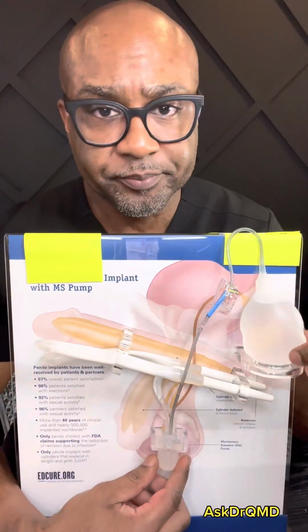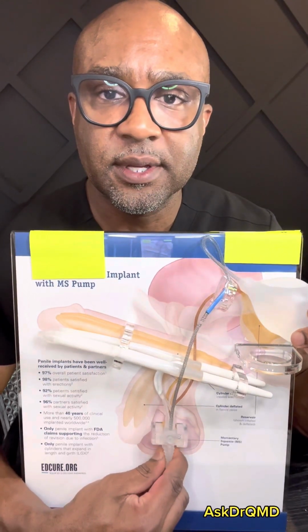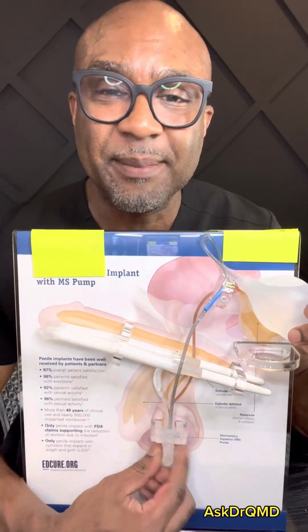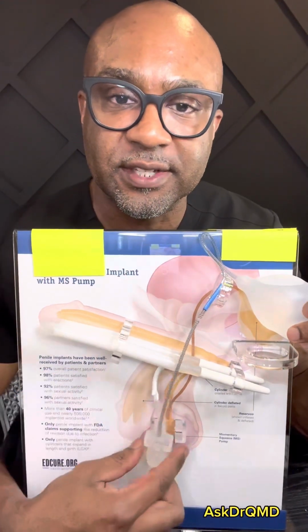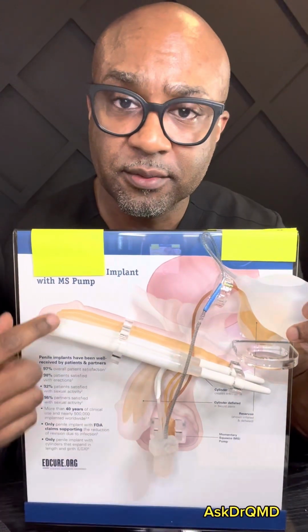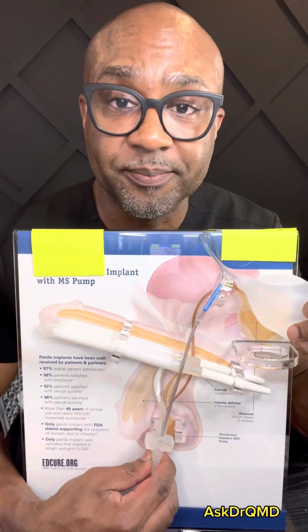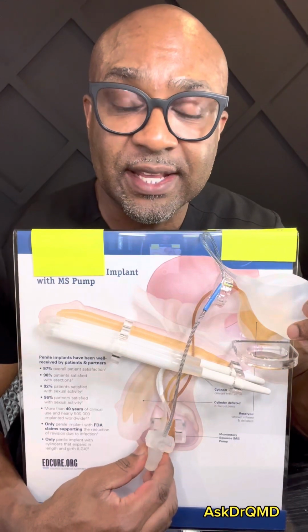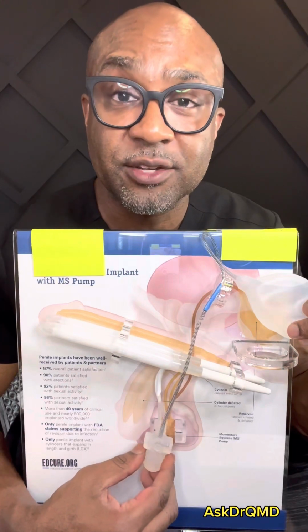So essentially, what this looks like is, if I give it a squeeze, you start to see that fluid slowly fills up the prosthetic. You see that when I'm squeezing, I'm not going fast, I'm not pumping. I'm actually letting fluid, as I release, fill in the cylinders. As I'm doing that, you see the prosthetic is filling out. You see you have two, one on each side. And so this pump, you just basically pump until you can't pump anymore. Now there's no tissue around this, so I can pretty much pump indefinitely. But the prosthetic that I place expands in both length and girth to mimic your natural erection, okay?